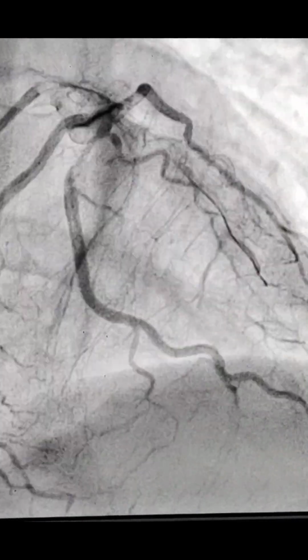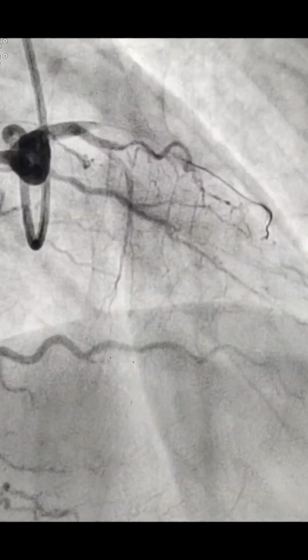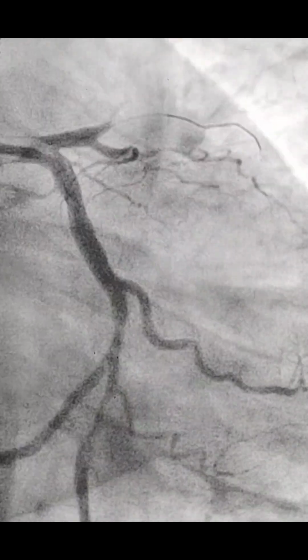in the LAD. But even after crossing the wire, the LAD has not opened. So we did the serial balloon dilatation with the NC balloon. The same thing we could see here. The LAD wire has been crossed, but there's no flow in LAD. So this is a balloon dilatation.